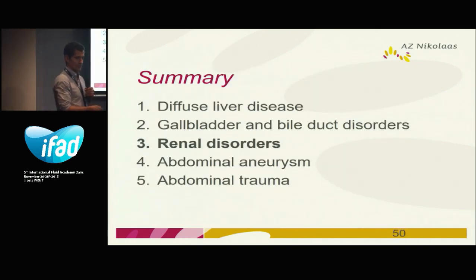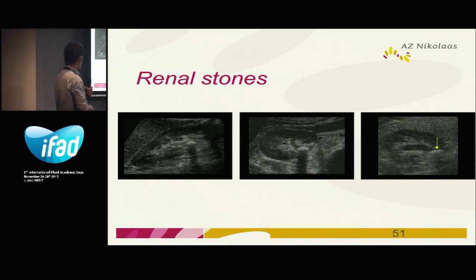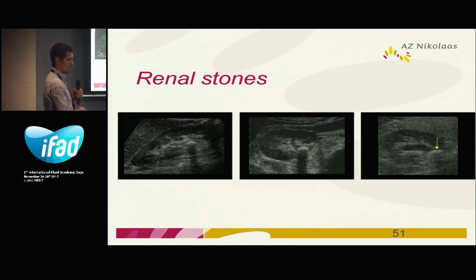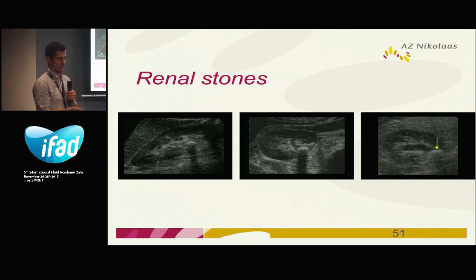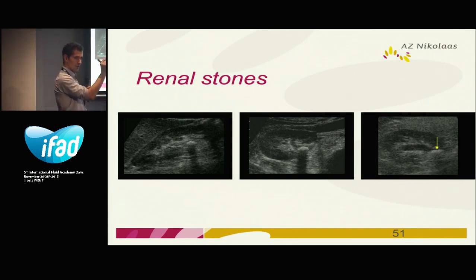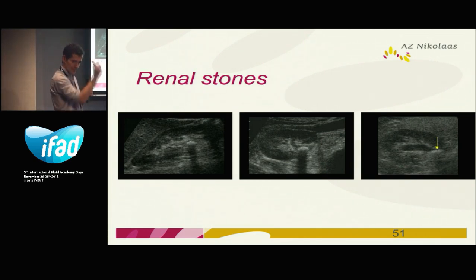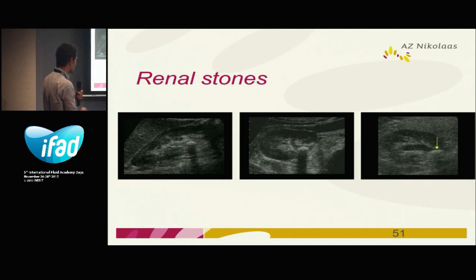Let's go to renal disorders. First, renal stones — this is the kidney, and here you see a hyperechoic region with a shadow. If you see this, it's a stone. This is also very important for bile ducts — a hyperechoic lesion with a clear shadow is a stone. Here again, this is the kidney, this is a kidney stone, and here again with a less clear shadow, but still a kidney stone.